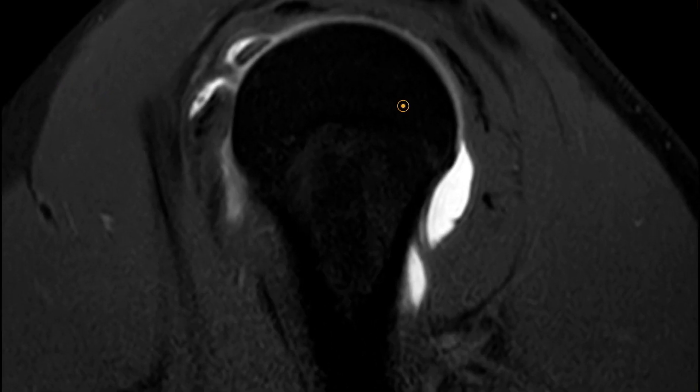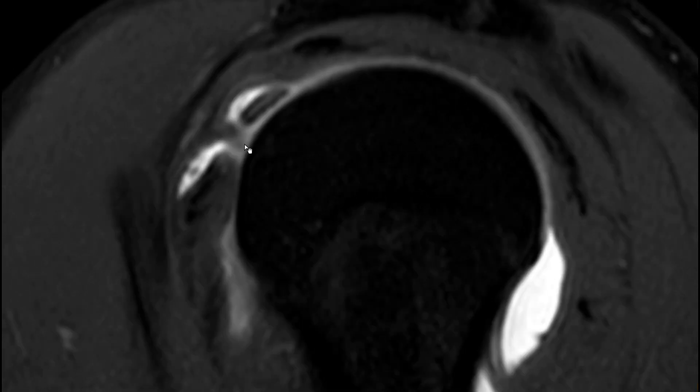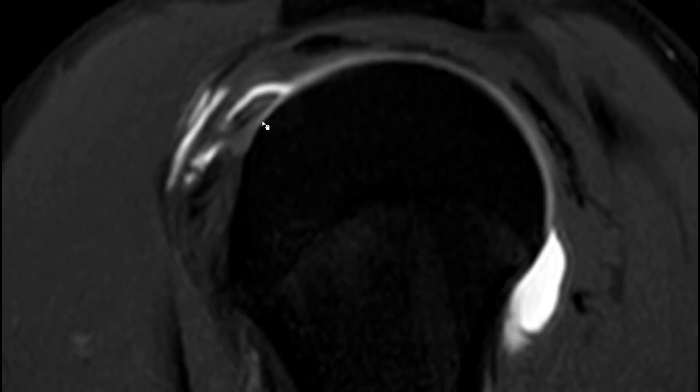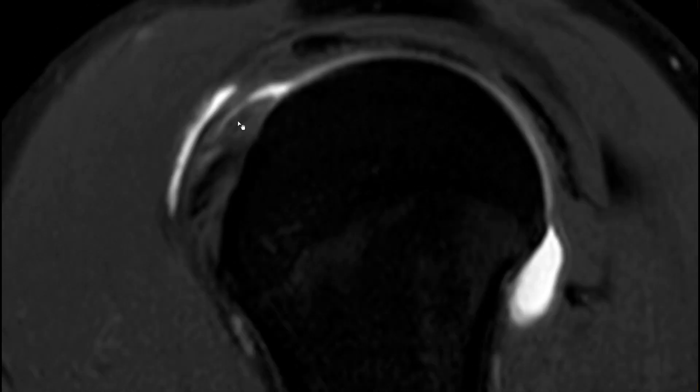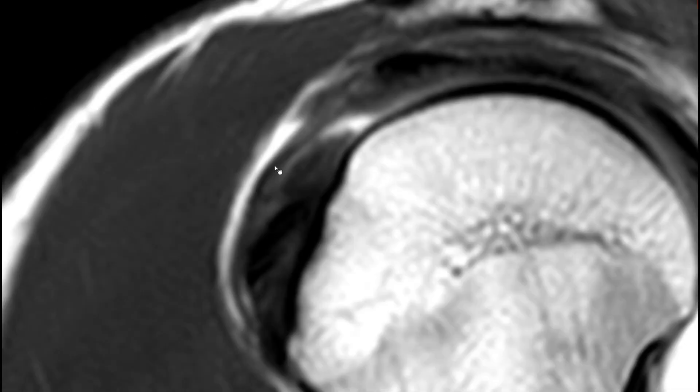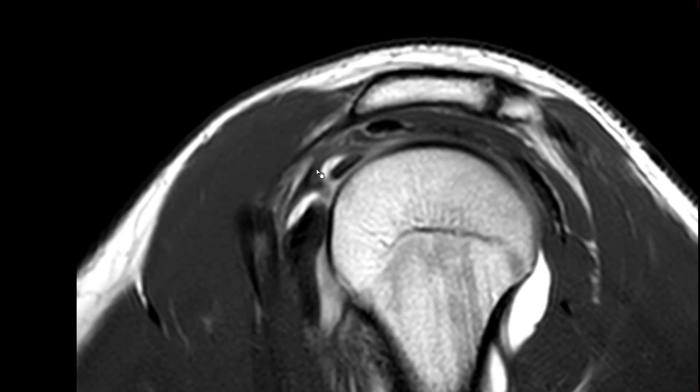On this T1-weighted fat-saturated sequence you can also see the pulley — if you scroll through, sometimes you can see this sling. It's really hard to see if you don't have arthrography or any fluid in the joint, so I wouldn't bother too much. But even if you don't really see it, always make sure that the biceps tendon is more or less in the middle between the subscapularis and supraspinatus. That said, even this sign is not always easy: going slightly more medially or laterally it's no longer in the middle. I just look at the sagittals for this sling — if I can see it, it's probably okay; sometimes it's thicker, sometimes thinner, sometimes torn.